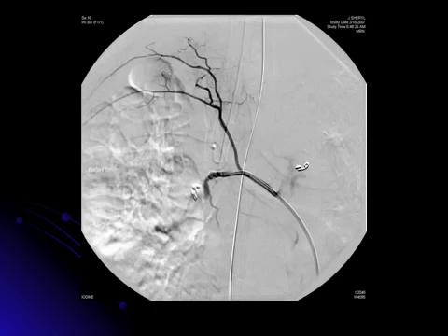After the completion of embolization of this vessel with the biospheres, several small coils were placed and then repeat arteriography was obtained. You can see that there are intercostals visualized at this point. We did not see a spinal artery, which does occur in up to 5% of cases off of the bronchial artery.